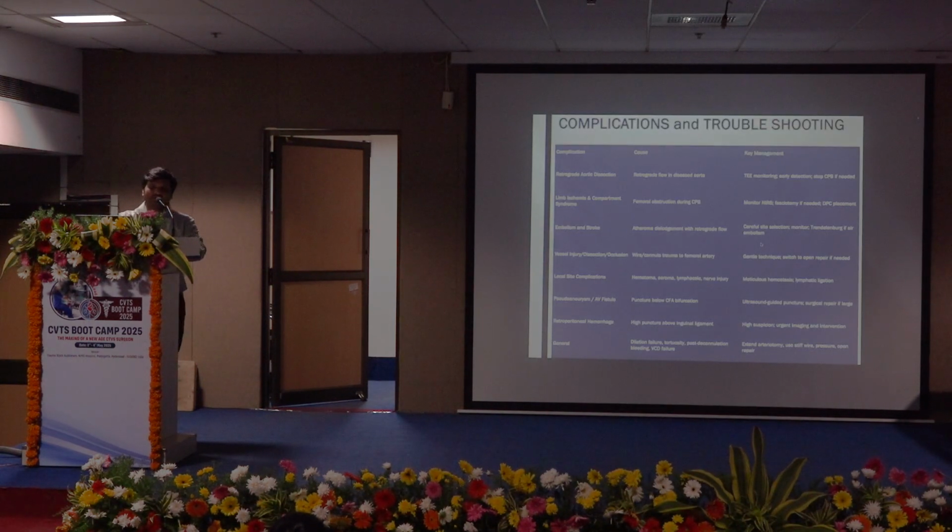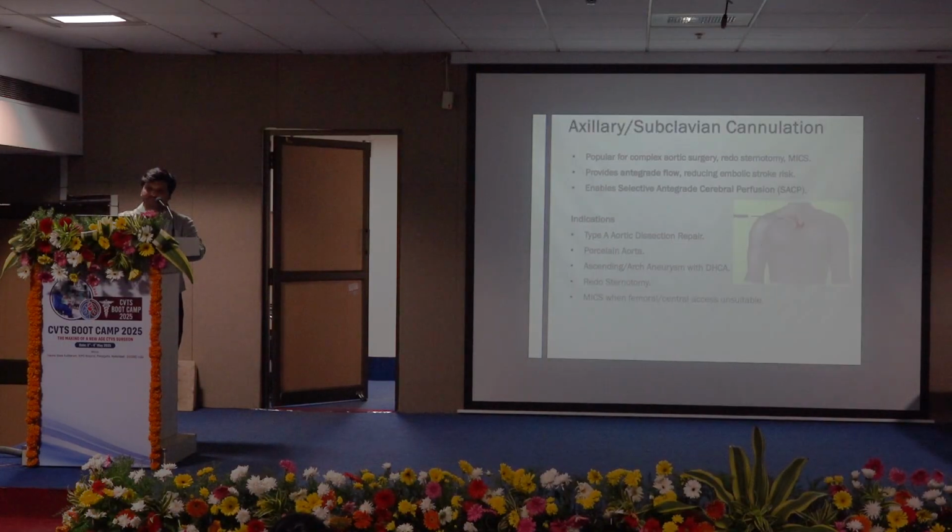Complications like retrograde aortic dissection, limb ischemia and compartment syndrome, embolism and stroke, vessel injury, local site complications, pseudoaneurysm formation, retroperitoneal hemorrhage, dilation, tortuosity and post decannulation bleeding are common complications seen with femoral artery cannulation.